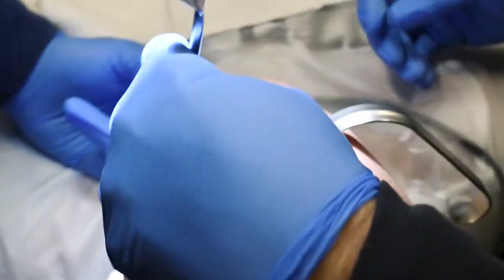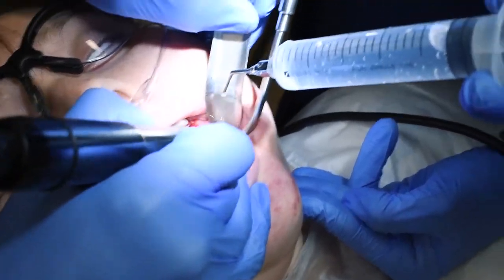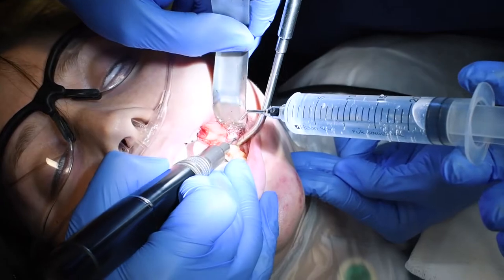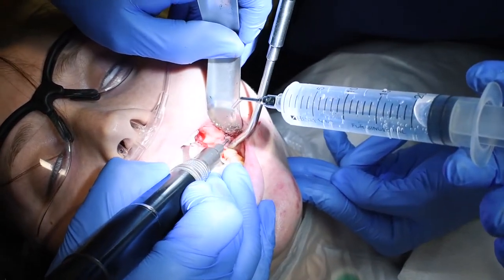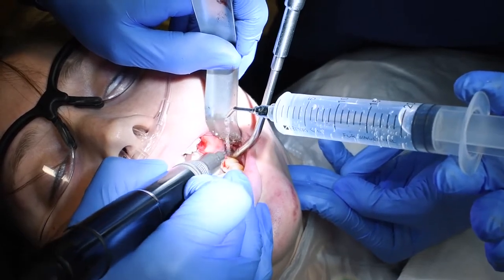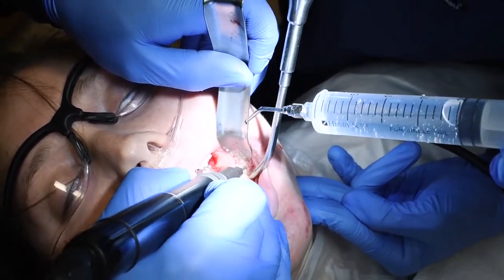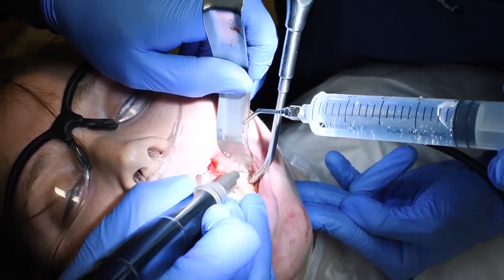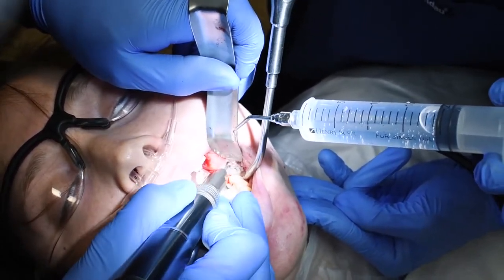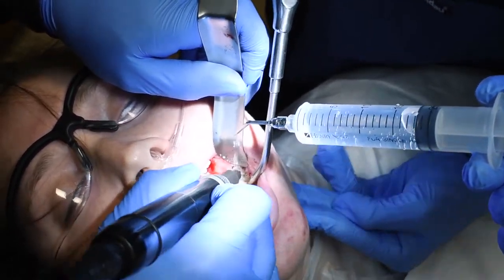Can I have the drill next, please? I'm going to cover this first. As it's going, you can see there's lots of irrigation — we need to keep pouring water to keep things cool. Justin, you have to move your tip — I don't want to cut the tip in half. We need more irrigation, more water to keep things super cool.